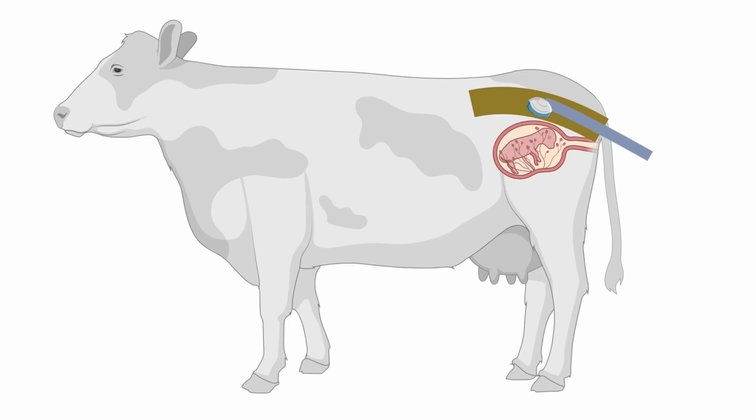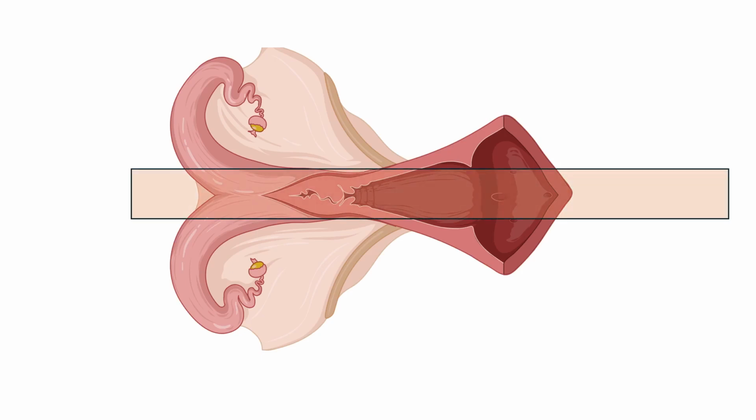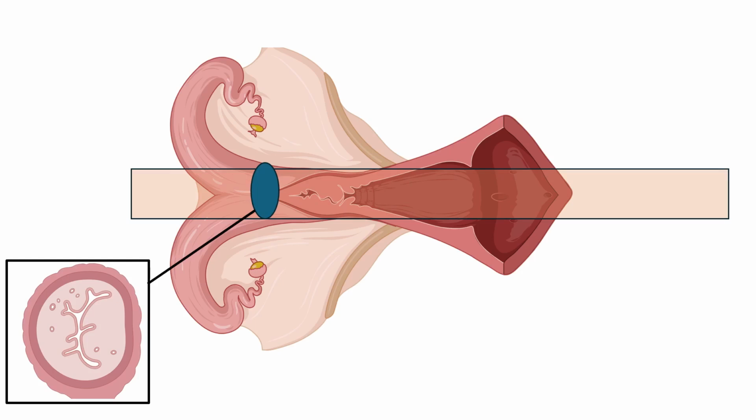So what are we actually looking at when we're scanning cattle? If we're going transrectal, that probe is facing downwards into the uterus and fetus, scanning through potentially different fetal structures. It's important to remember that when you're scanning, you're getting a cross-section of the image. A useful way to do this, if possible, is to use your scanner on uteri from the abattoir. Placing the scanner in one direction will give you a cross-section of the uterine body and uterine horns. Turning the scanner will give you another cross-section, so looking through the lumen or the middle of that structure.